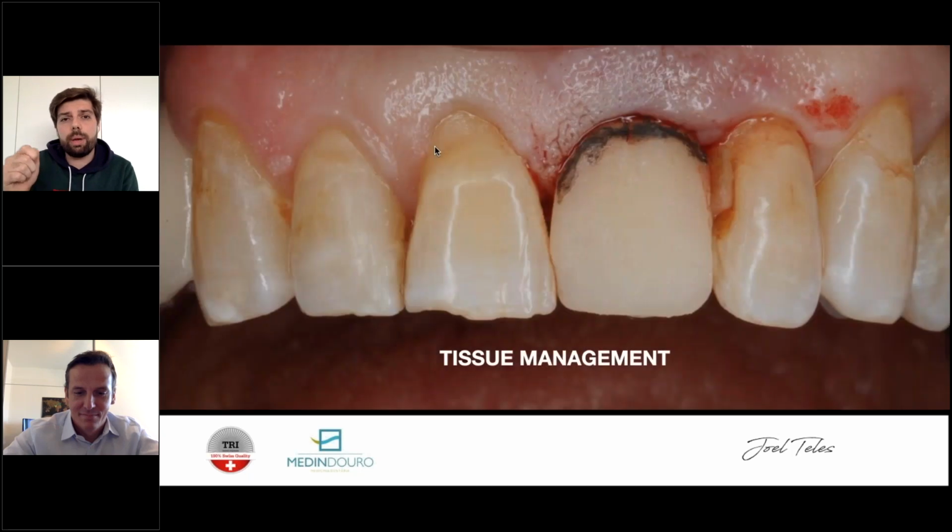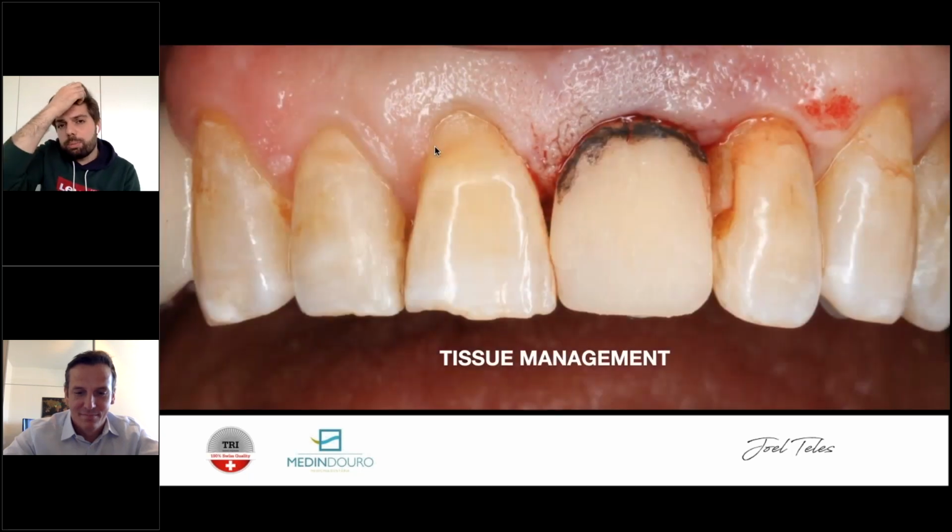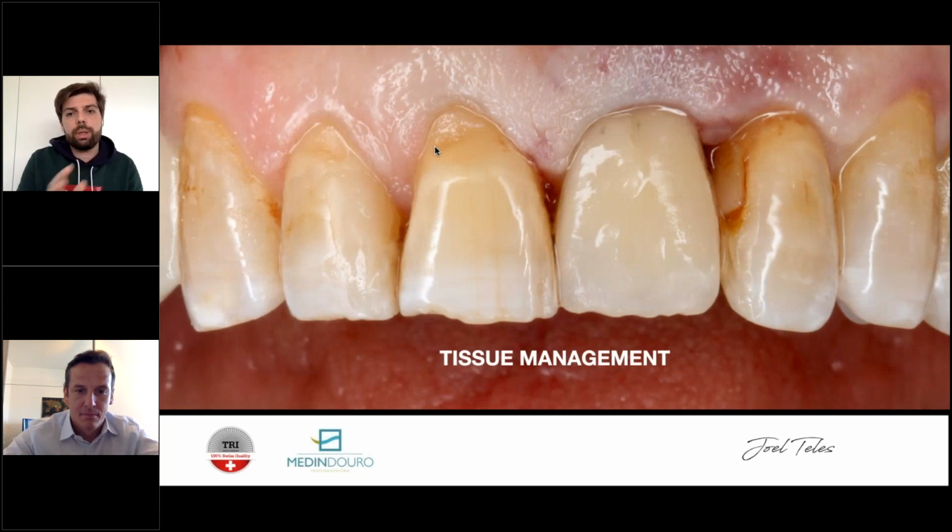Afterwards, I'll go back into the patient's mouth, and I see what I need to reshape. Okay, this is my first trial. I look at the crown and I see where it's compressing the tissue. What do you feel once it gets in? And you take it out again and you reshape it. And once you're sure everything is in the right position, you're ready to go.